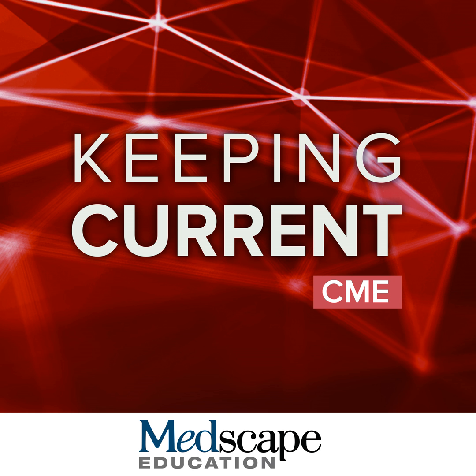And so when I'm interpreting these images, I think it's really important that we talk about the distribution, as we heard Raymond talk about before, using the AHA segments to talk about which segments are involved. We also talk about, of course, whether base, mid, and apical segments are involved. And then also the wall thickness, and that's really important to understand how long the myocardium was ischemic before it was reperfused, of course.